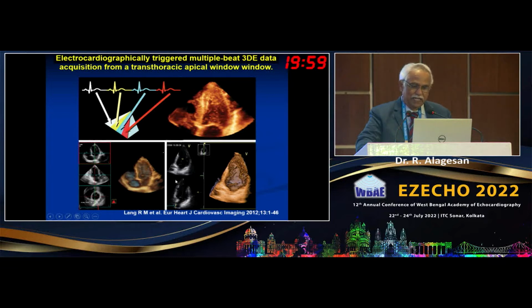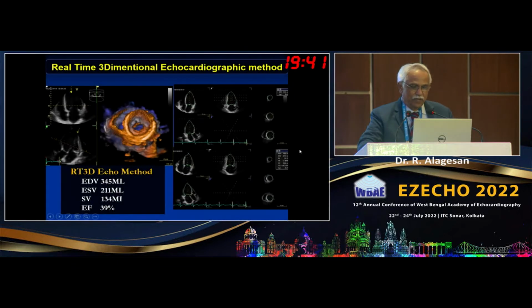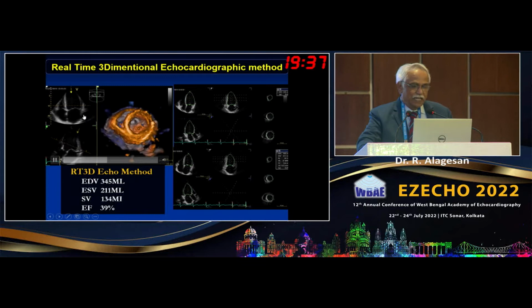When the 3D data set is good, then the volumes obtained are meaningful. If you have, say, garbage in, they say garbage in, garbage out. If the two-dimensional echocardiographic pictures and the three-dimensional echocardiographic pictures are not good, then your data is not going to be good.